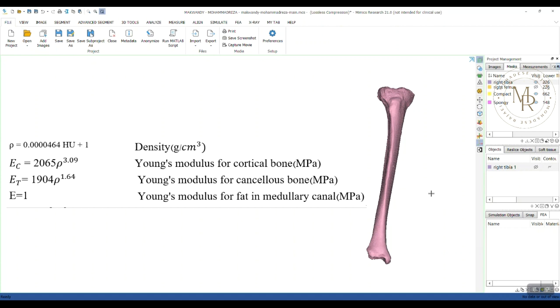For those of you who don't know what is HU or Hounsfield unit, Hounsfield scale is the semi-quantitative method of measuring x-ray attenuation. Typical HU values are from minus 20 to minus 150 for adipose tissue, and 20 to 50 HU for kidney. In other words, it's a relative quantitative measurement of radio density used by radiologists in the interpretation of computed tomography or CT scan images.